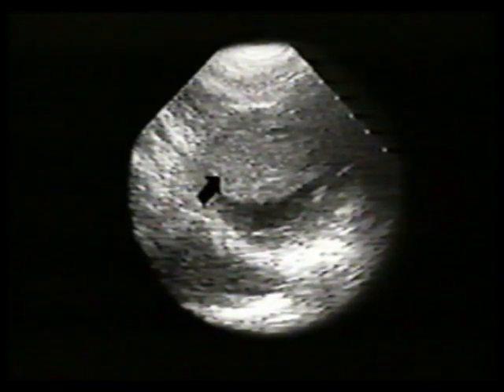This is an apical short axis view, again demonstrating the large mural thrombus which fills the apex.